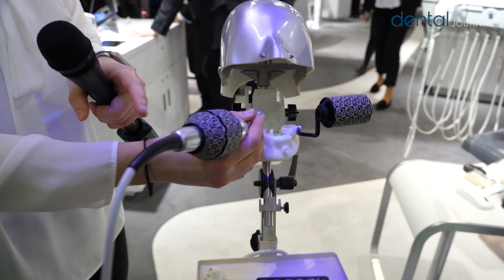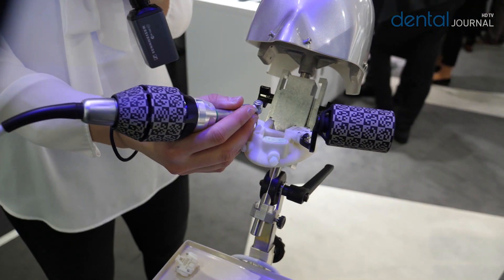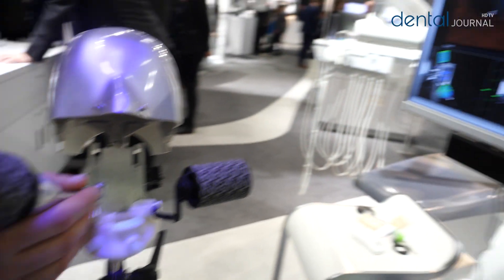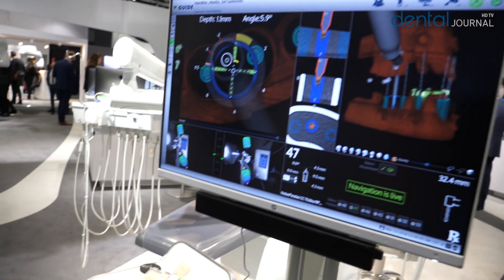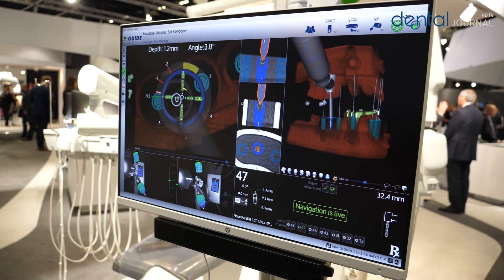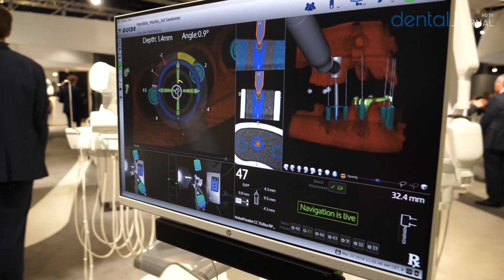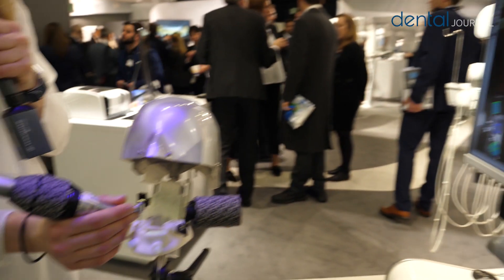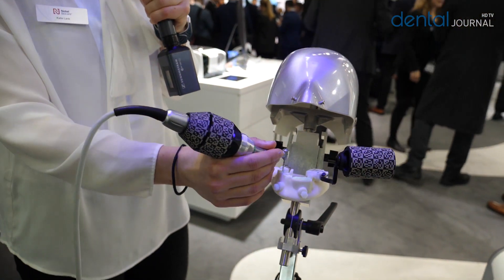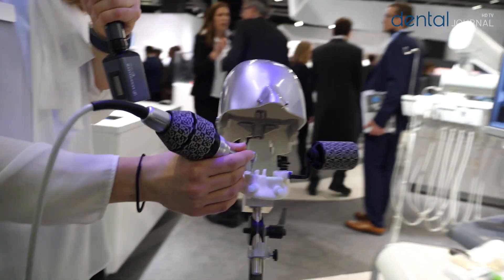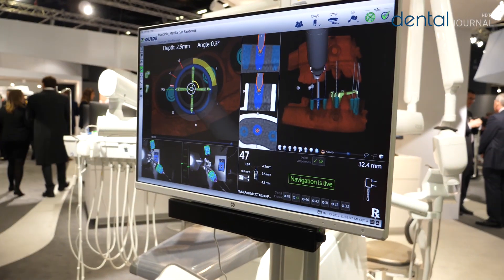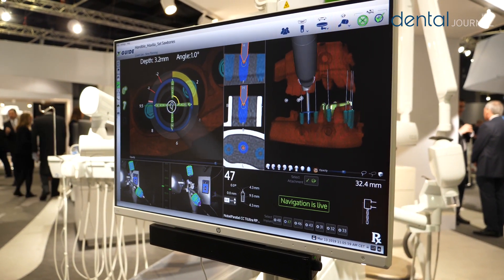You can see here's the pattern on my contra angle, which is actually being tracked by these cameras. And when I place it on the osteotomy site that I would like to drill — in this case which is 4.7 — the software zooms in automatically. So as I move my handpiece on the bone, those movements are captured in real-time on the software screen as well.